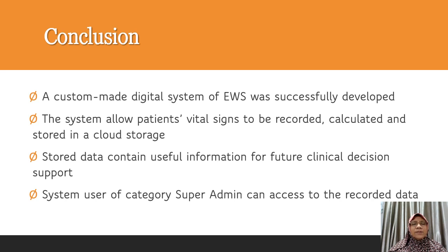So as a conclusion, in this project, we have managed to develop a custom-made digital system of EWS. The system allowed the patient's vital signs to be recorded, calculated, and stored in a cloud storage. Stored data contain useful information for future clinical decision support, and the system user of category super admin can access the recorded data.